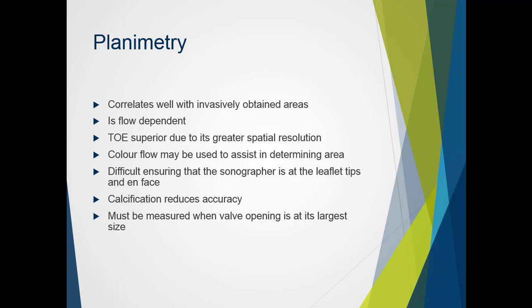Dense calcification reduces accuracy, as there may be artifactual representations, but also blooming, associated bright areas on the screen from strong interface. The valve must also be measured when the valve is opening at its largest size, and it may be difficult to determine which frame that exactly is.